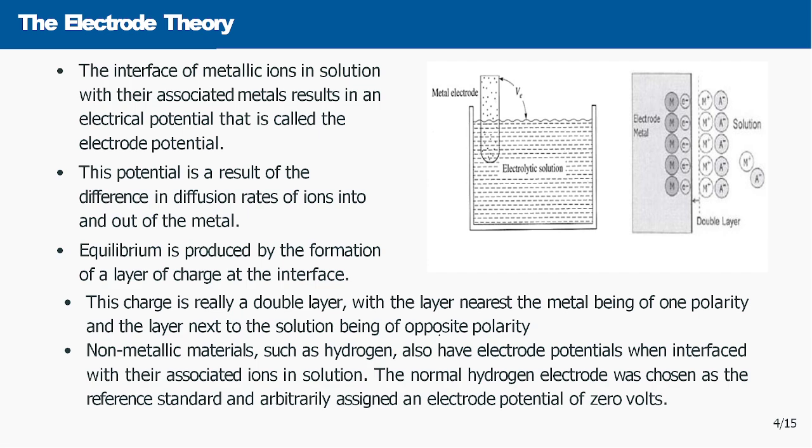Now, whenever we come across any electrode-electrolyte system, an interface is developed. This is called the metal-electrolyte interface. You can mark this interface when one metal electrode is placed inside an electrolytic solution. This is the interface which has been zoomed in here.